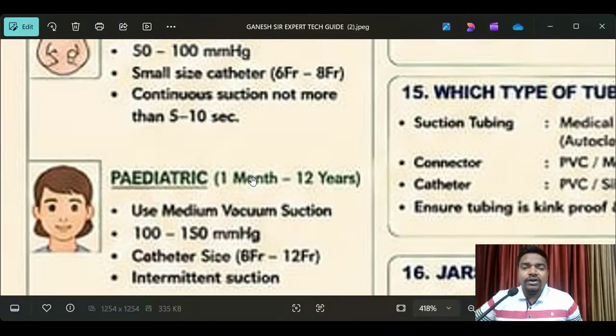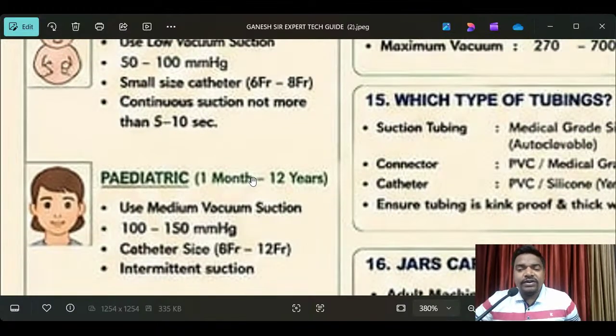As a biomedical engineer, we do not provide the services ourselves, but we have to give instructions to the hospital technicians who are operating the medical equipment, because we have to give proper advice and proper training. These things are very, very important. That is the responsibility of the biomedical engineers. That's why I'm saying this here.